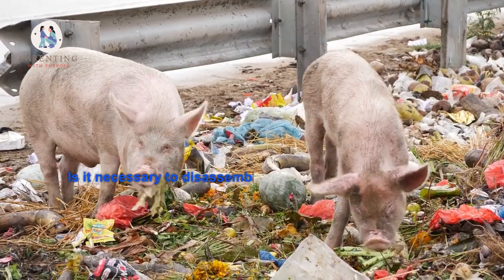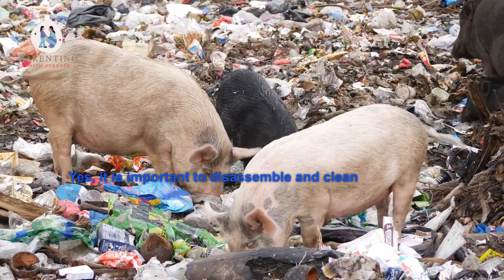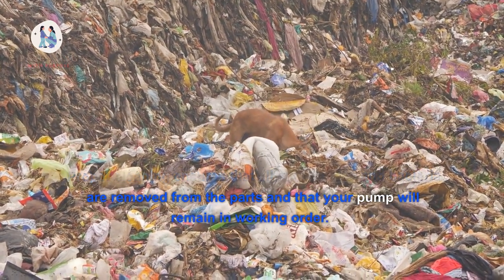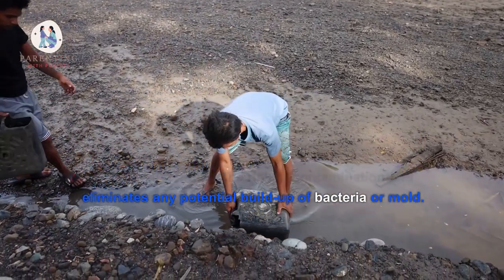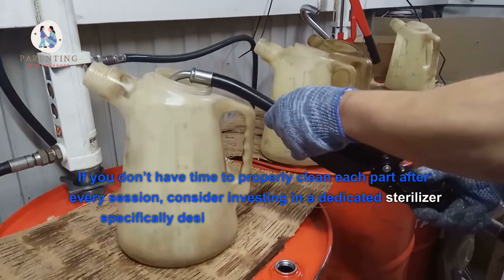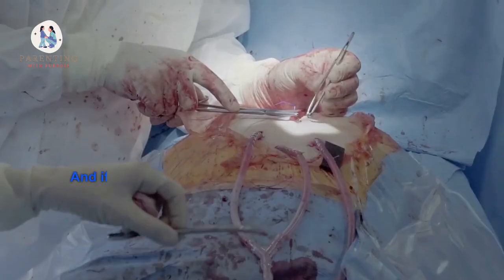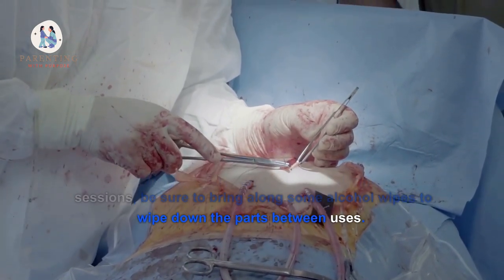6. Is it necessary to disassemble and thoroughly clean each part after every feeding session? Yes, it is important to disassemble and clean each part of the pump after every feeding session. Proper cleaning ensures that all milk residue and bacteria are removed from the parts and that your pump will remain in working order. It also helps reduce the risk of contamination and eliminates any potential buildup of bacteria or mold. If you don't have time to properly clean each part after every session, consider investing in a dedicated sterilizer specifically designed for breastfeeding pumps. This device can quickly sanitize several pieces at once, making post-session care much simpler. And if you find yourself away from home during pumping sessions, be sure to bring along some alcohol wipes to wipe down the parts between uses.